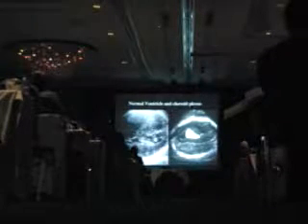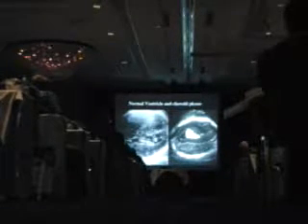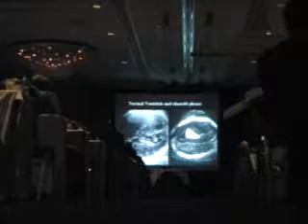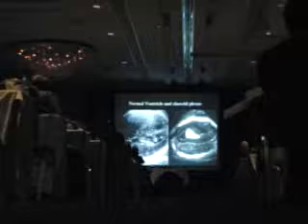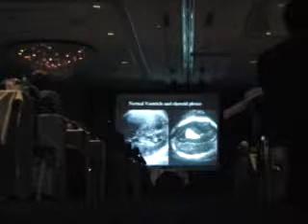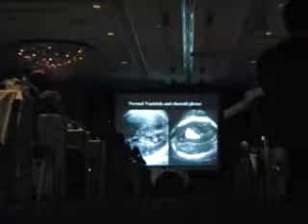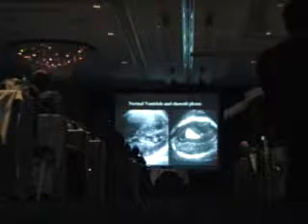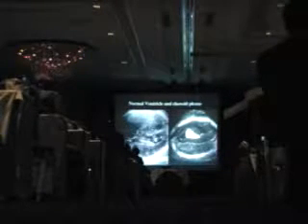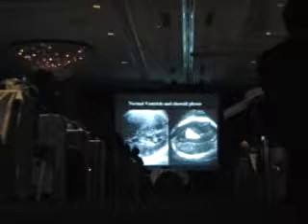Now, as the ventricle develops, and we'll spend a little bit more time on the ventricle in a minute, the choroid becomes smaller and smaller with respect to the size of the overall brain. If you remember early on, the choroid took up really the majority of space in the head that we were imaging. And here, in the third trimester, it is present in only a small portion of the brain, and most of the brain is actually something else, not the choroid plexus. But the choroid plexus still is an excellent marker for where that ventricle is, and we measure the lateral ventricle at the atrium, which is the very end of where the choroid is, and you can measure it.